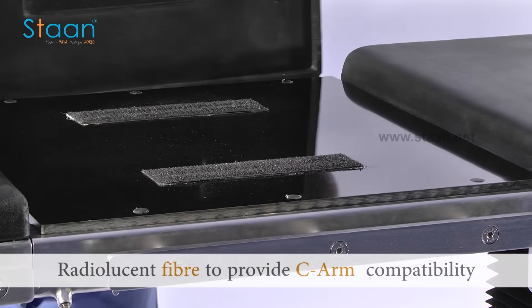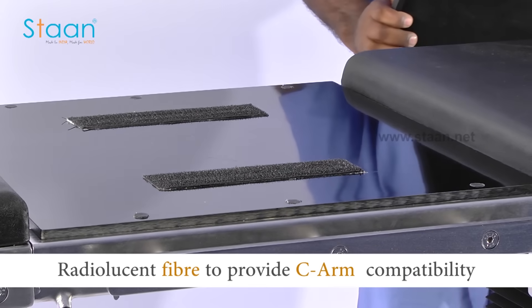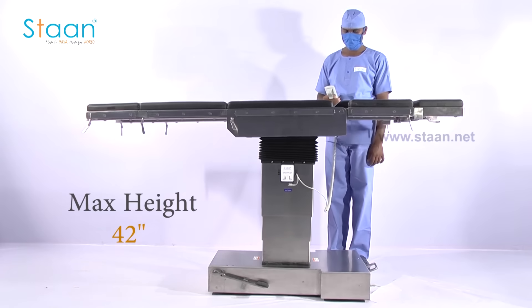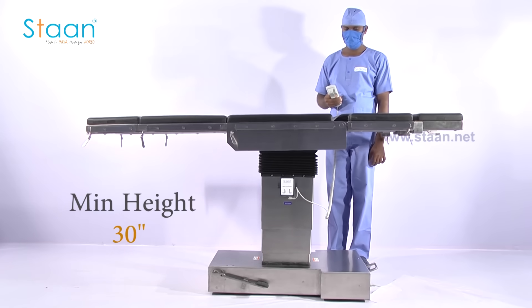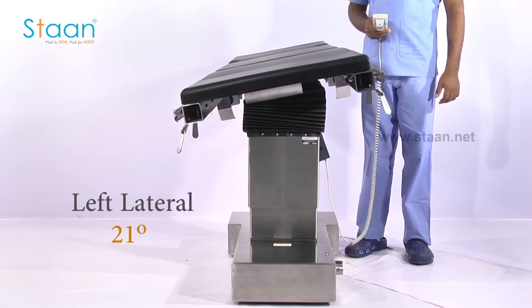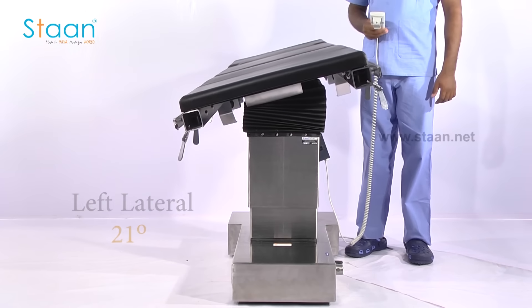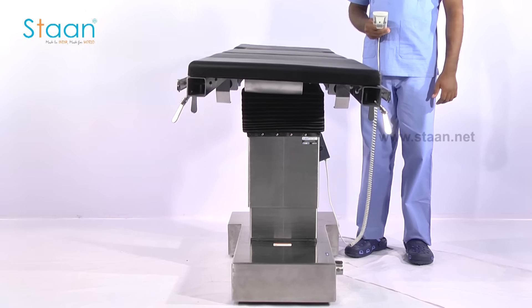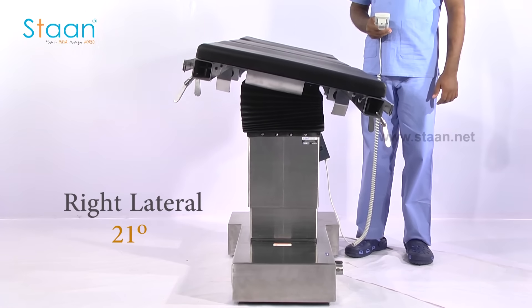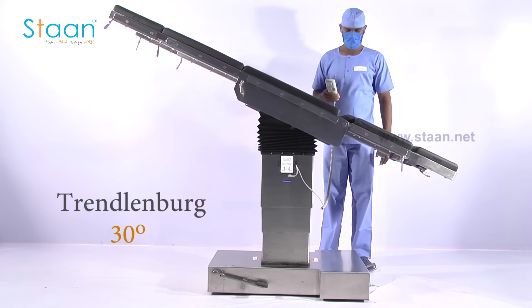The table top is covered with special radio-lucent strong fiber material in order to provide C-arm compatibility. It can be operated to a maximum height of 42 inches and a minimum height of 30 inches, with left and right lateral tilt of 21 degrees, and Trendelenburg and reverse Trendelenburg of 30 degrees.